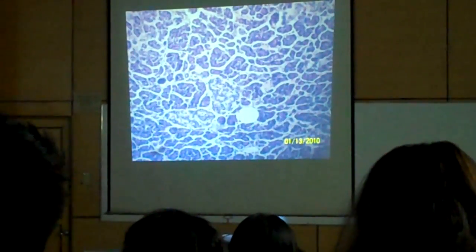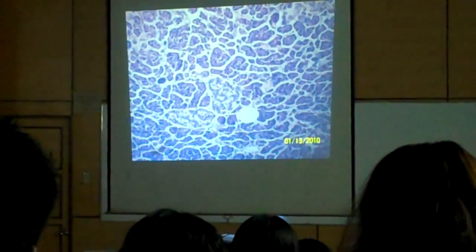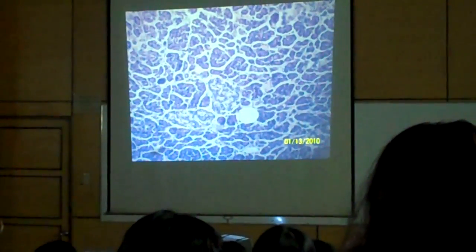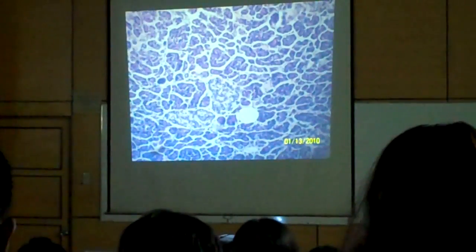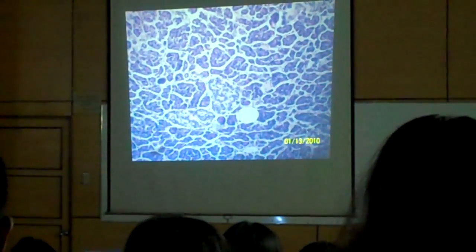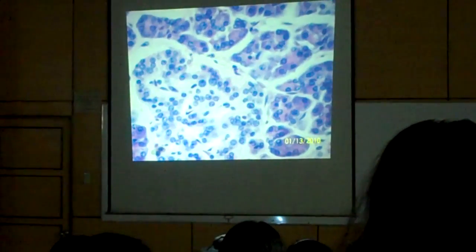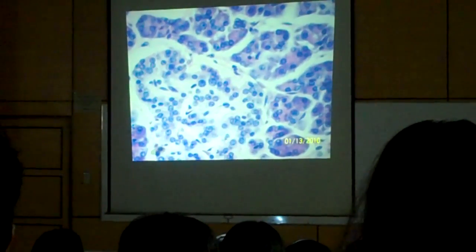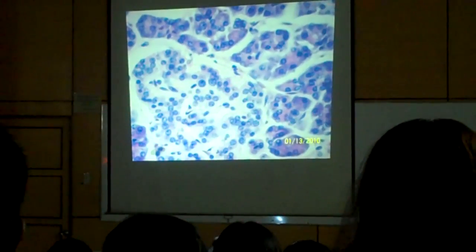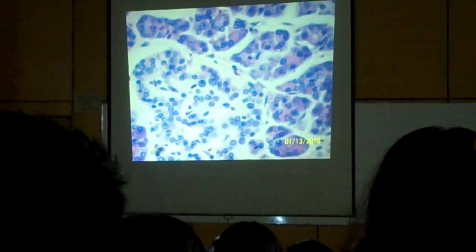In any slide, for you to be able to identify a part of the slide, we will show you relationships of the different morphologic structures within the organ. So again, the islet. Another question would be, we can ask you to give the hormone that the pointed structure is secreting, or give the cells comprising the bracketed structure.